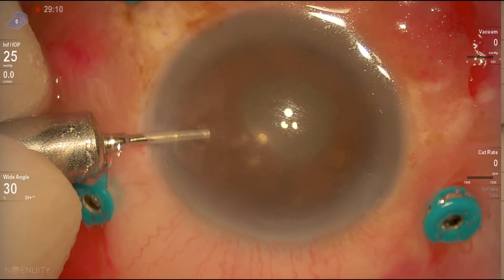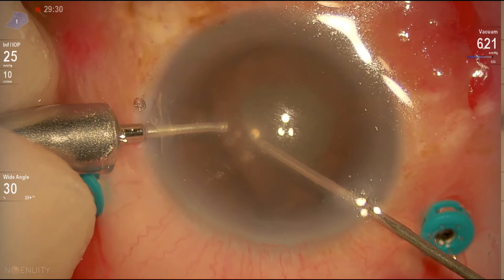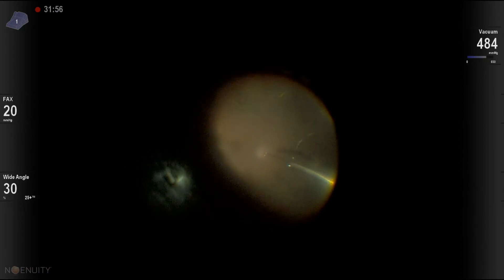The reason is to leave the vitreous cavity air-filled. So we have to clean the anterior chamber from the viscoelastic before filling the vitreous cavity with air — otherwise it becomes very difficult working in the anterior chamber with air in the vitreous cavity.